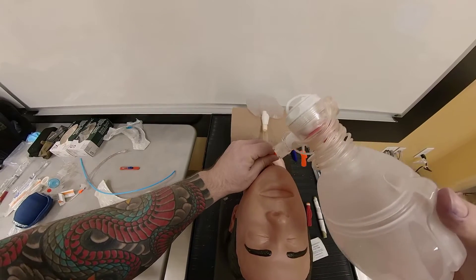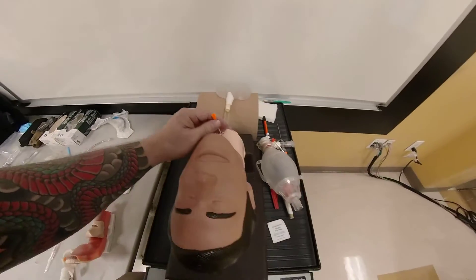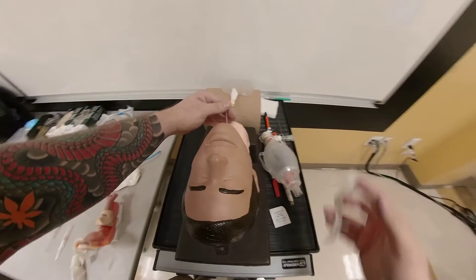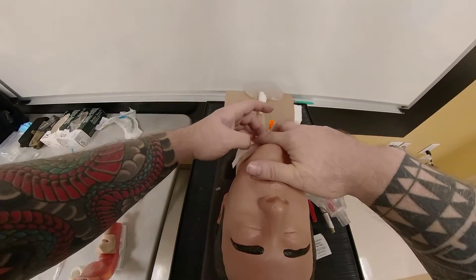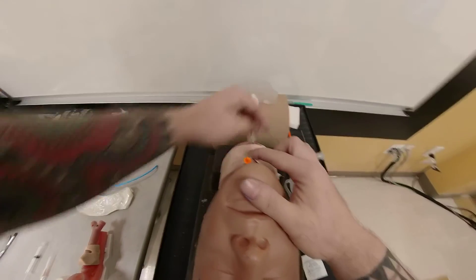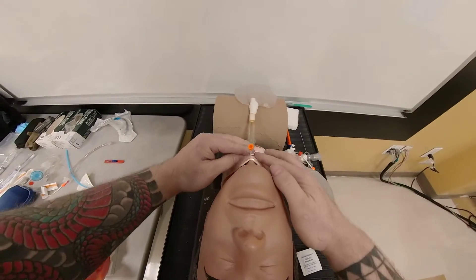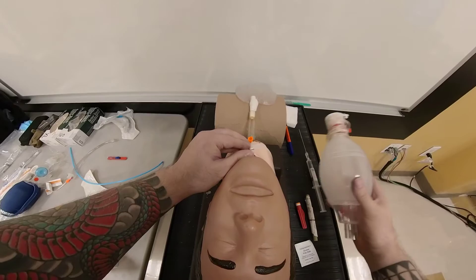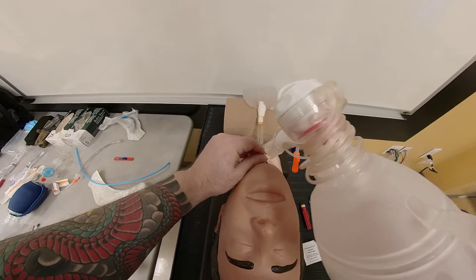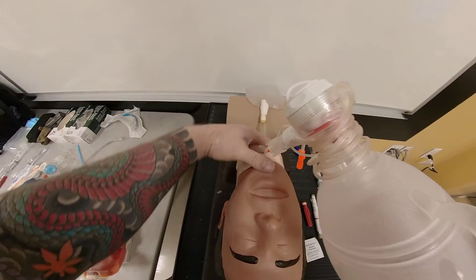You're going to pass this off to your partner. I don't let go of this even when I secure it, because I don't want to kink it. The way I'm going to secure it is with a chevron — which is how we teach you to start IVs. Put tape under and then do the criss-cross method. You could put more tape to reinforce, but regardless of how much tape you put, your hand stays in place here in order not to dislodge it.